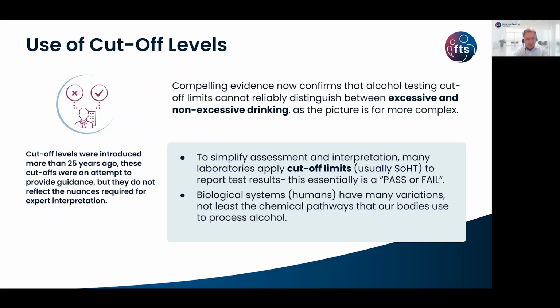So I've talked about cutoff levels. You might have seen other webinars where we talk about this in more detail. It's relevant to alcohol testing as well. Many laboratories still use cutoff levels that were introduced 25, 30 years ago. They were an attempt to provide some guidance then. They weren't really that accurate then, but now, because of what people do to their hair and the way laboratories have become more sensitive and specific, they're not really relevant anymore.